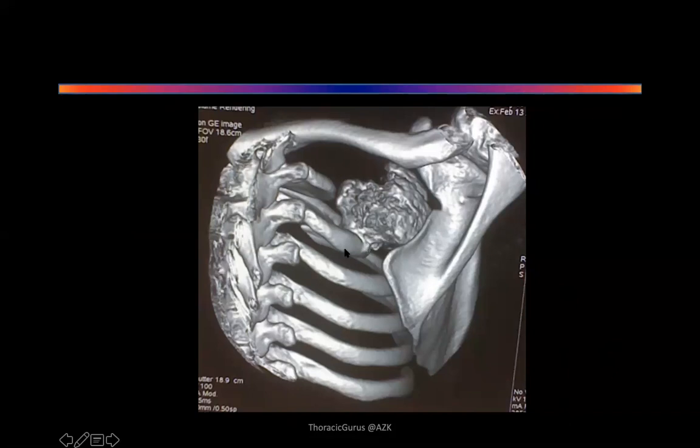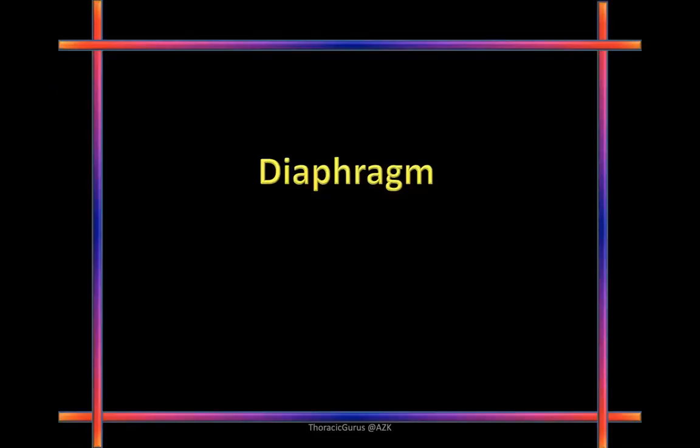Differential diagnosis. Posterior tumor. It could be osteosarcoma of the rib, osteoma, any of the bone tumors, from benign bone tumor, chondroma, all the way up to osteogenic sarcoma. On a CT scan, on this reconstruction, you cannot clearly say what it is. This needs a biopsy and histological confirmation of the tumor. It was actually a chondroma. Still got time? Everybody's okay?